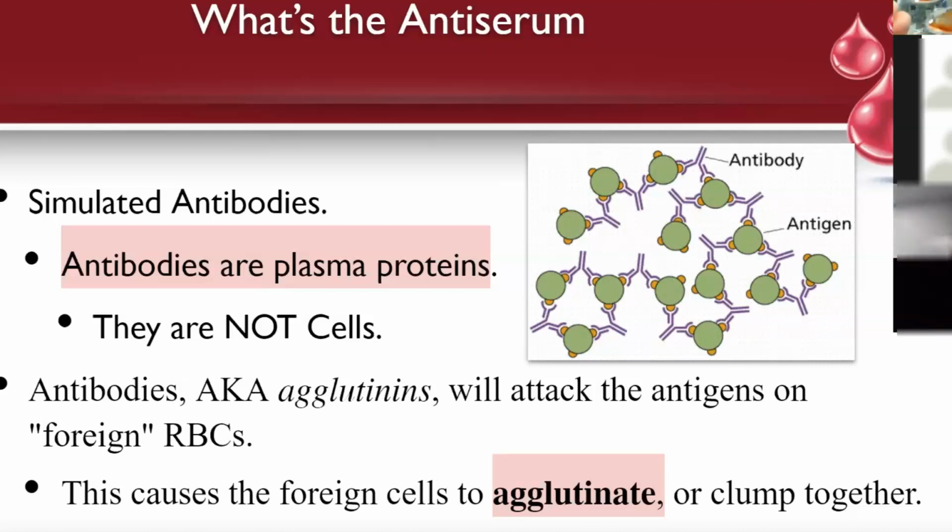Let me see. So down here, it's definitely clumping. Over here, I believe it looks like it's clumping. This one on this end is still liquidy, not clumping. See, drip. So this one clumped in A and RH, but it did not clump in B.